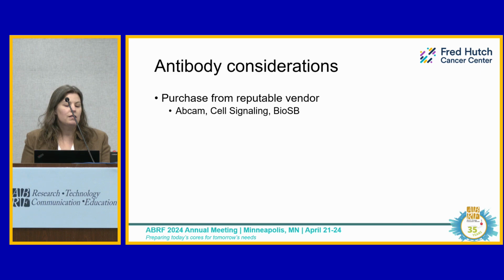So some antibody considerations when you're just getting started. I would suggest trying to purchase antibodies from a reputable vendor if possible. Something that has been shown to work in FFPE would be of value to start with.